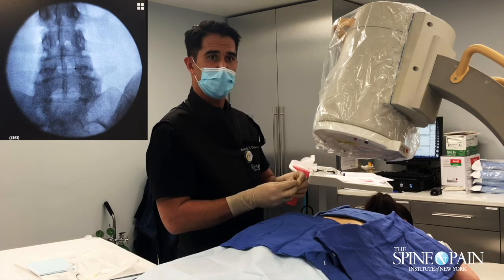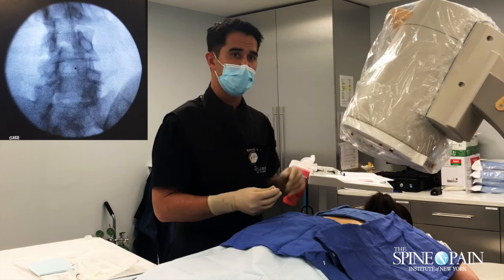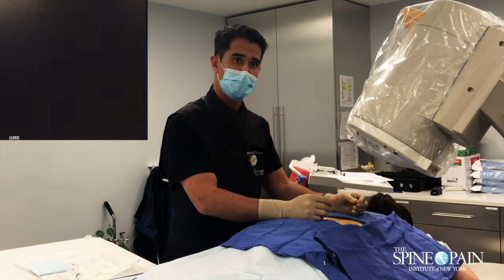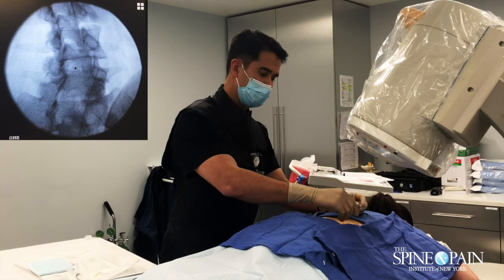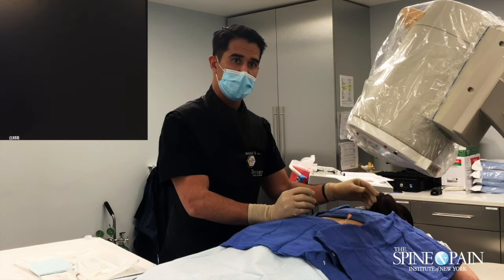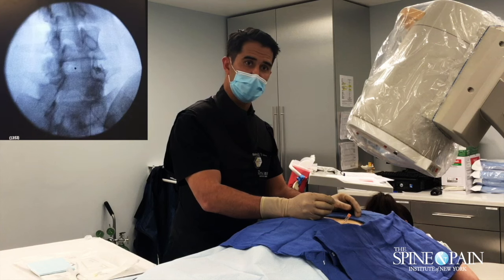The medial branch blocks innervate the lumbar facet joints, which are the joints in your back, and they can be damaged in an accident like the one she was in. That nerve is a little branch off the nerve root, and it wraps right around and innervates the joints above and below that level — right at the junction of the superior articular process and the transverse process, where the nerve is.